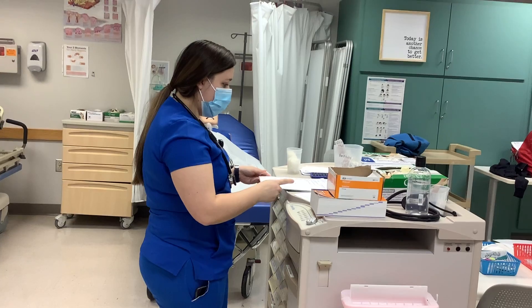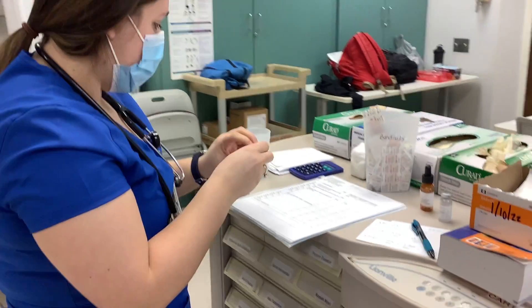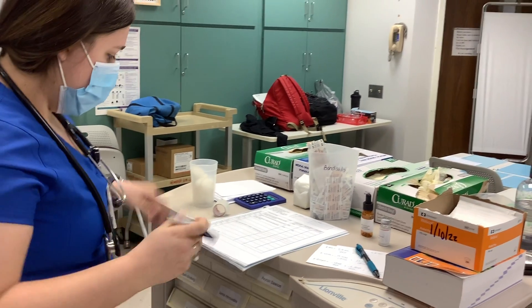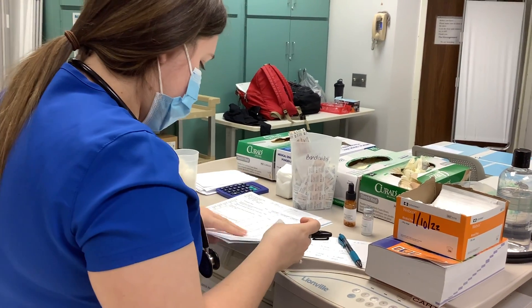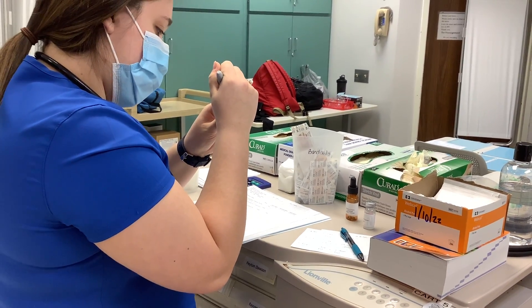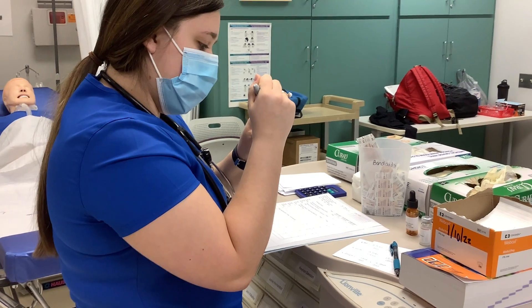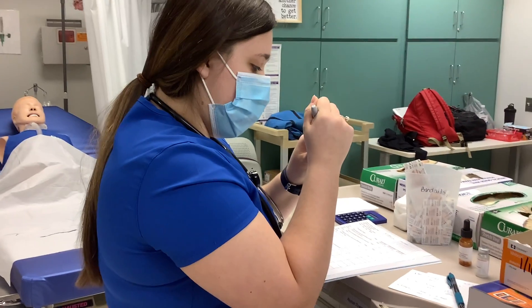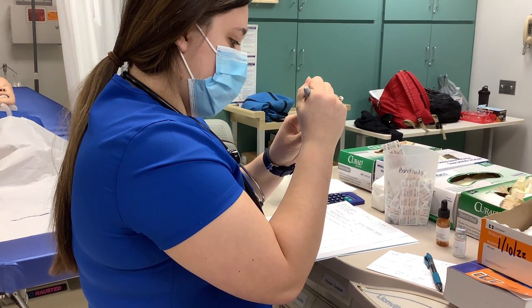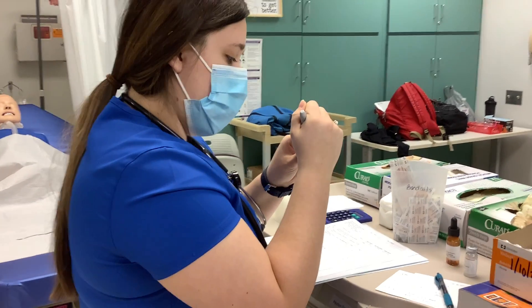Now we are going to start preparing our medications. First, I am going to write out my labels for my tape so that they are ready to go. The first one we are going to prepare is the Fluzone. I'm going to put patient's initials EJ, the drug name Fluzone, 0.5 mLs that will be in the syringe, my initials, the date, and the time — 0730.